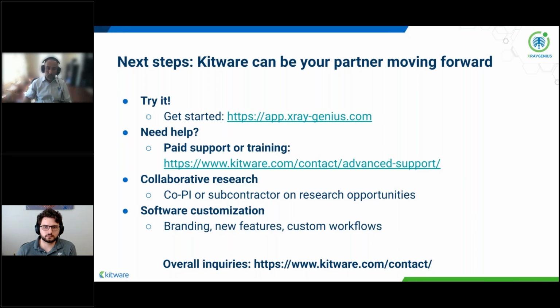So that's one way we can help. Second, as we indicated, the simulation backend is flexible. If you have a different simulation backend that you want to integrate within X-Ray Genius, we can help you do that as well. And also, the user interface right now uses Volview.